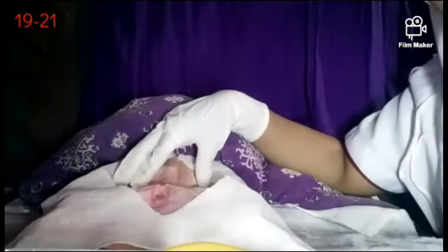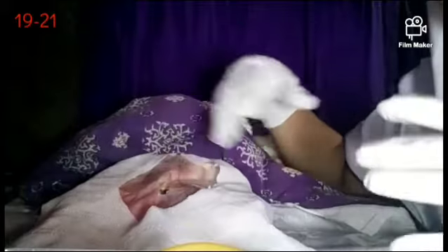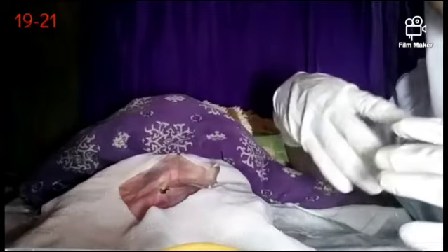Disinfect the meatus twice using a cotton ball with betadine, downward, then discard the used cotton ball and get another one, downward. The rationale for this is it cleans the area and minimizes the risk of urinary tract infection by removing surface pathogens.